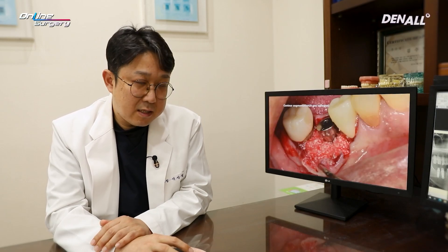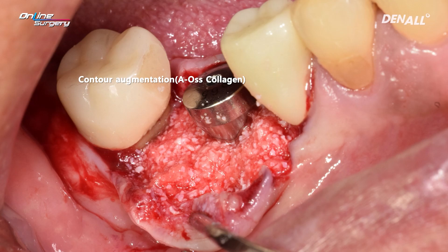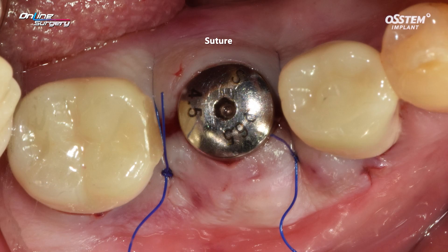So implant position is determined like this. AOS collagen is used as the graft material. Particulated bone can be used, but in this patient the defect is a contained defect and volume stability can be gained from adjacent bone. Particulated bone can move around, so AOS collagen is applied in this case, which makes surgery very easy. An interrupted suture was made — two sutures were performed in the proximal area. The ISQ was about 75, indicating good stability, so it was finished with one-stage surgery. Let's have a look at the surgery video.